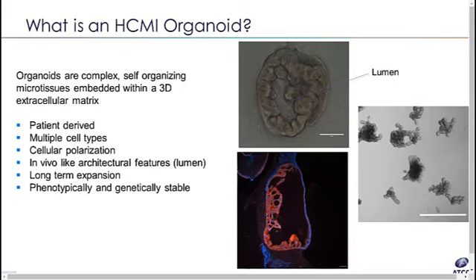Similar to classical cell lines, they exhibit long-term expansion. They can undergo multiple passages while being shown to be phenotypically and genetically stable.